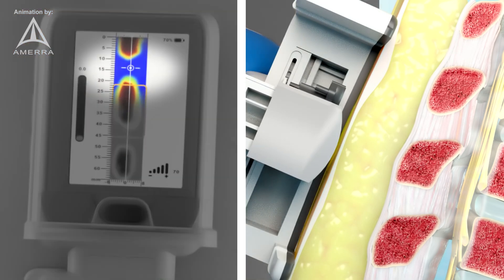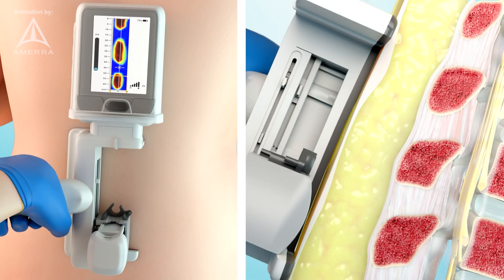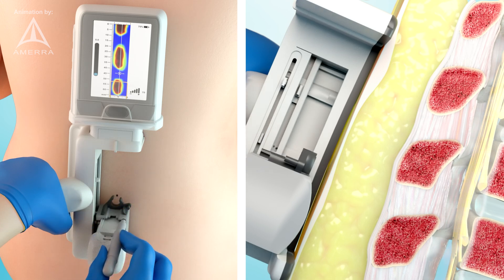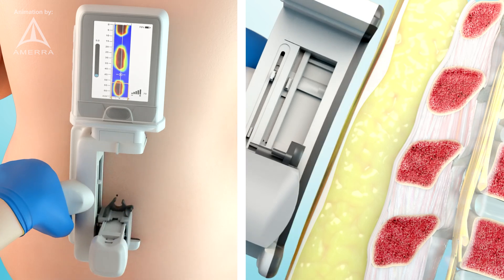The white crosshair on the screen corresponds to the location of the marker guide on the device. Slide the applicator until the crosshair aligns with a selected insertion site. Place the surgical marker through the marker guide to mark the site.